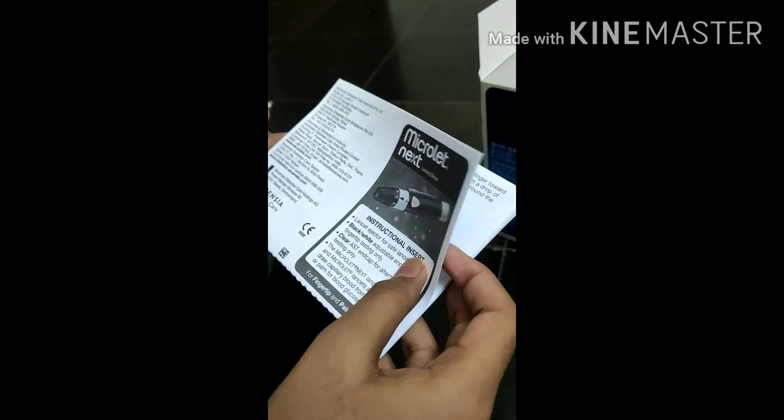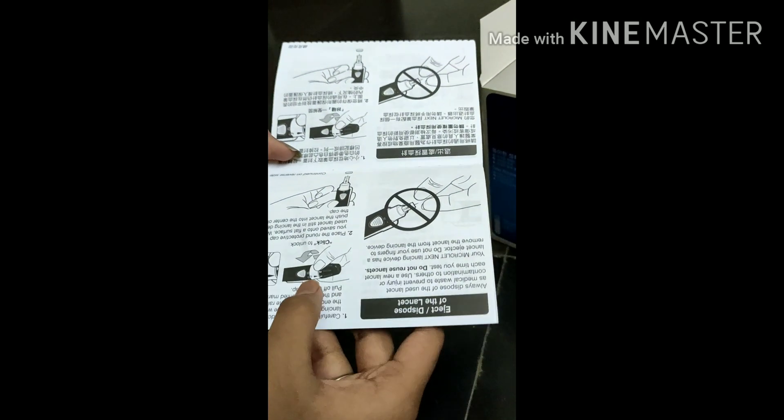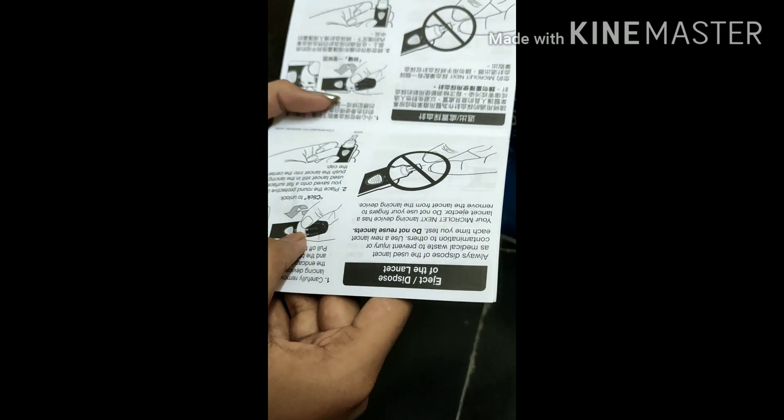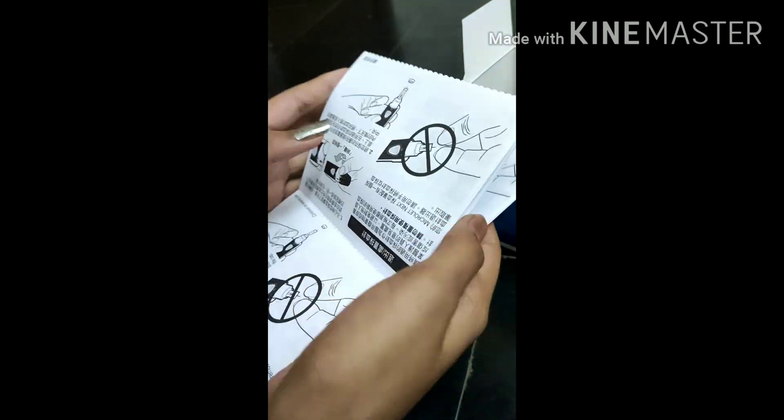Next is the lancing device. This is the lancing device we have inside the box. I will show you how that will work.